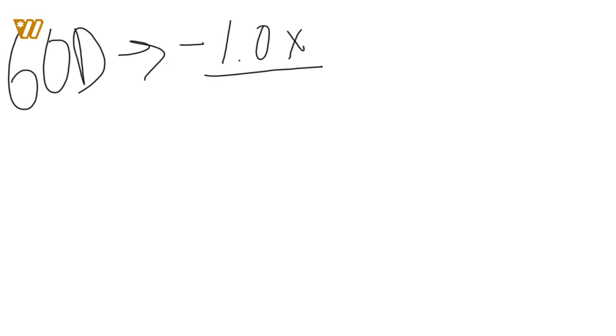So let's talk about how that comes into play. We've talked a little bit about telescopes so far, and we're going to get more into telescopes when we get into low vision as well. But whenever you think about a fundus lens and an eye, we put our eye up here, and we put our fundus lens in front of the patient. What's going to happen is we're actually going to create a telescope system, with an objective and an ocular.